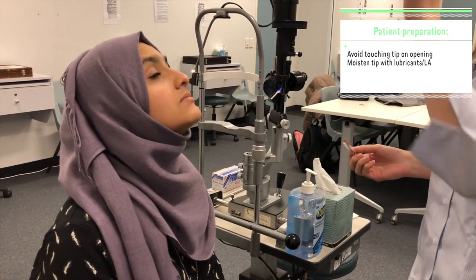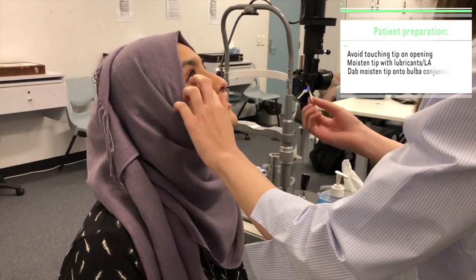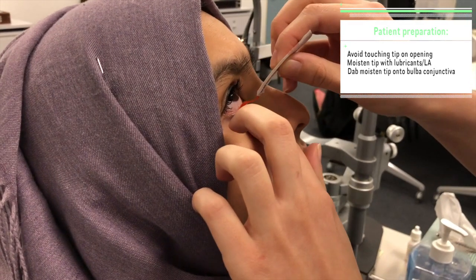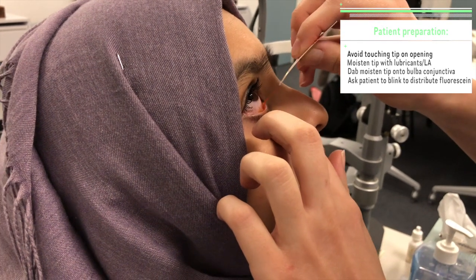Instruct the patient to look up while you gently pull down their lower lid. Apply using a gentle dab the moistened tip of the fluorescein strip to the bulbar conjunctiva. Ask the patient to blink several times to distribute the fluorescein.